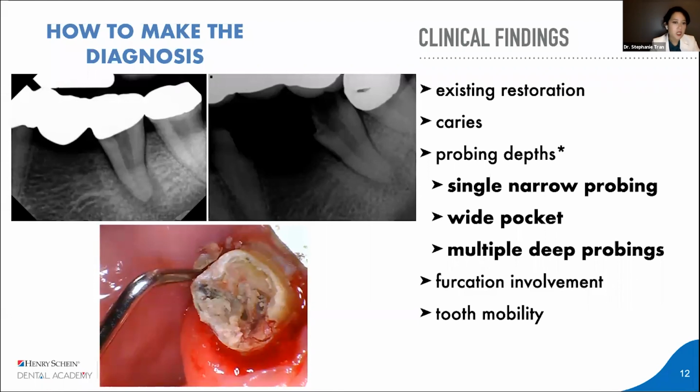Some things, of course, are much easier. So in this case, this patient, the bridge actually came off, so it was much easier to confirm the diagnosis. Although in this case, it looks like a J-shaped lesion, that doesn't automatically mean a vertical root fracture. A lot of times, a very long-standing chronic apical abscess can manifest itself in sinus tracts that come up the side of the tooth or a deep probing up the side of the tooth.